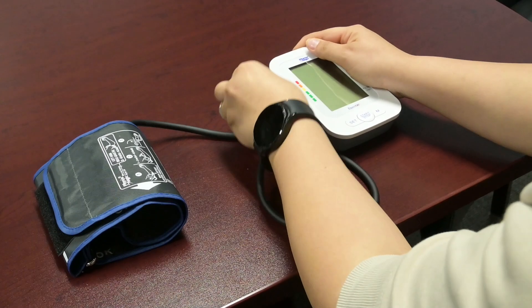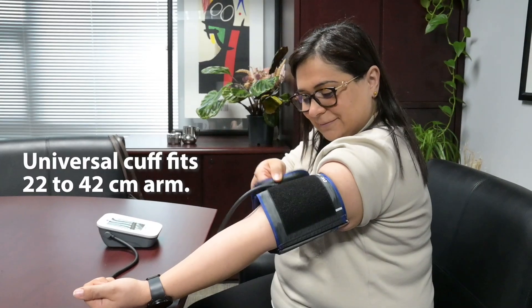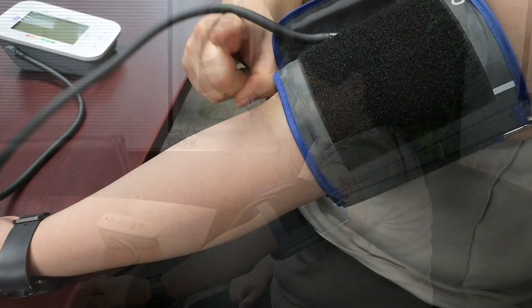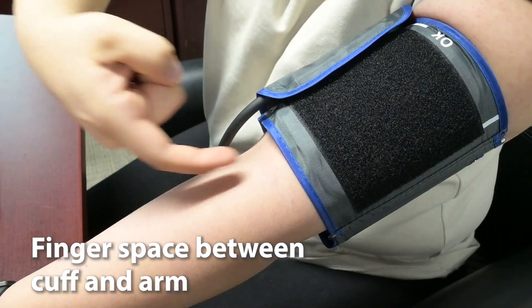Let's get started. Firmly insert the plug into the machine. Place the cuff around your upper left arm and allow for one finger above the elbow and inside the cuff so that it fits snug.